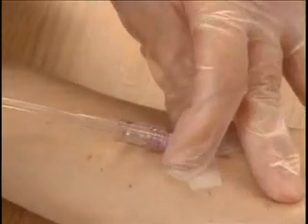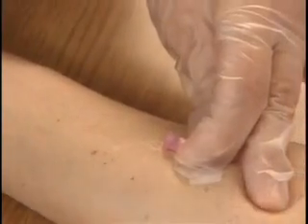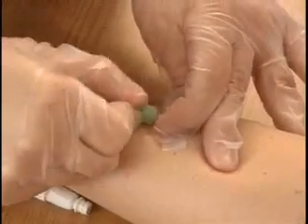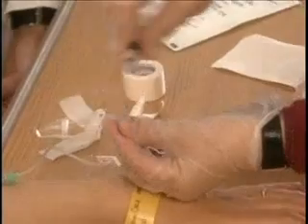Now I'll stabilize the IV catheter hub. With my other hand, I'll quickly twist and disconnect the IV tubing from the IV catheter. Now I'll take my primed extension tubing, remove the end cap, and attach it to the IV catheter hub. Be careful to not contaminate the ends of the tubing, okay? Now I'll clean the end cap and flush it.